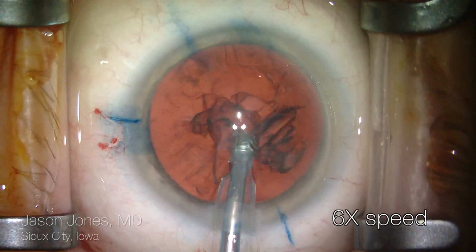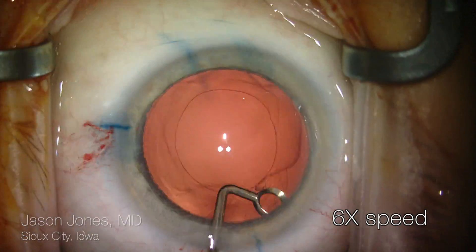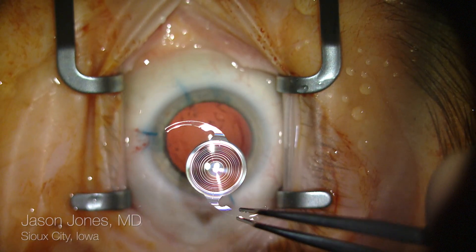After removal of the cataract and cortex, we're going to move on to curating the capsular bag and then finally implanting the lens.